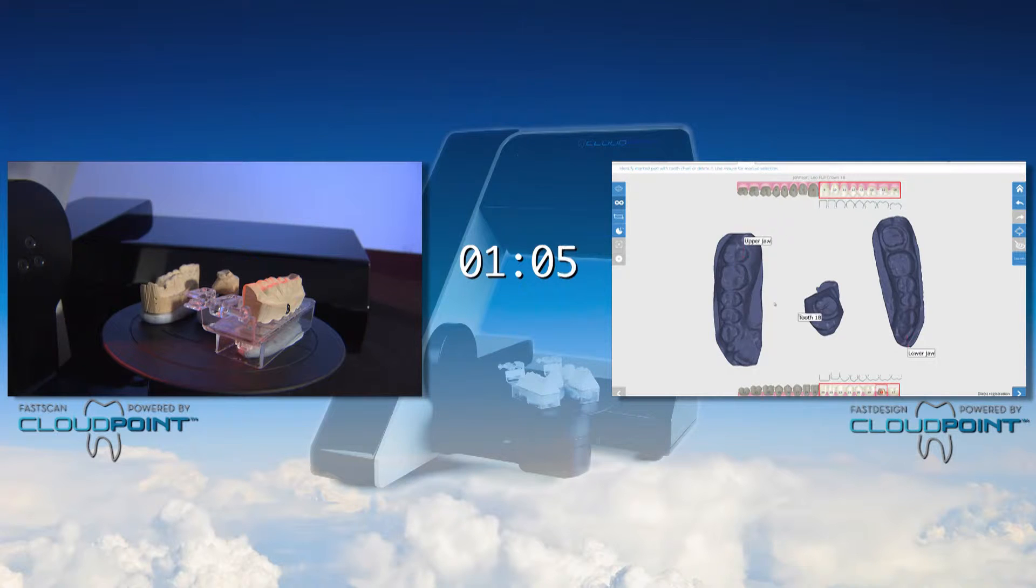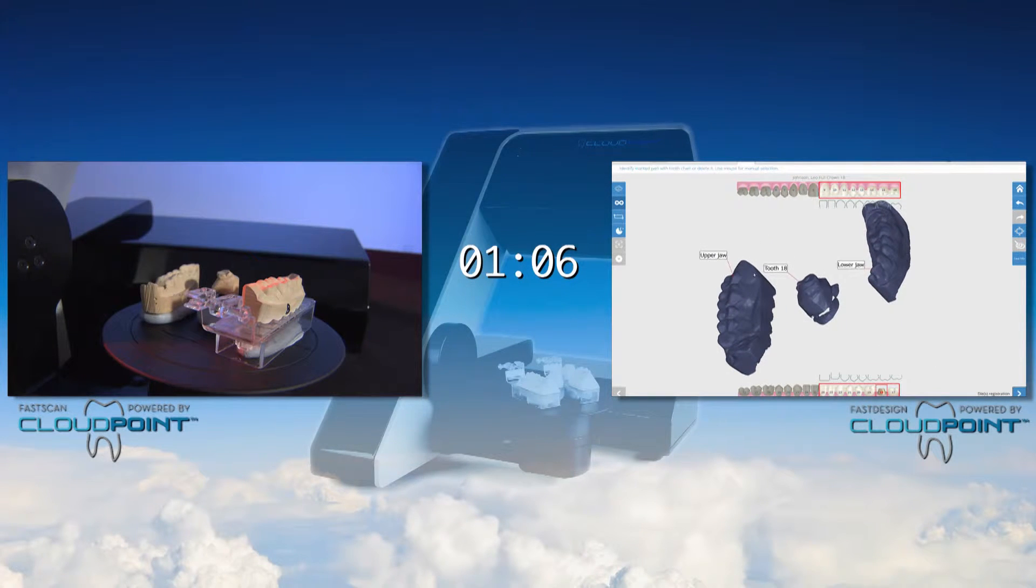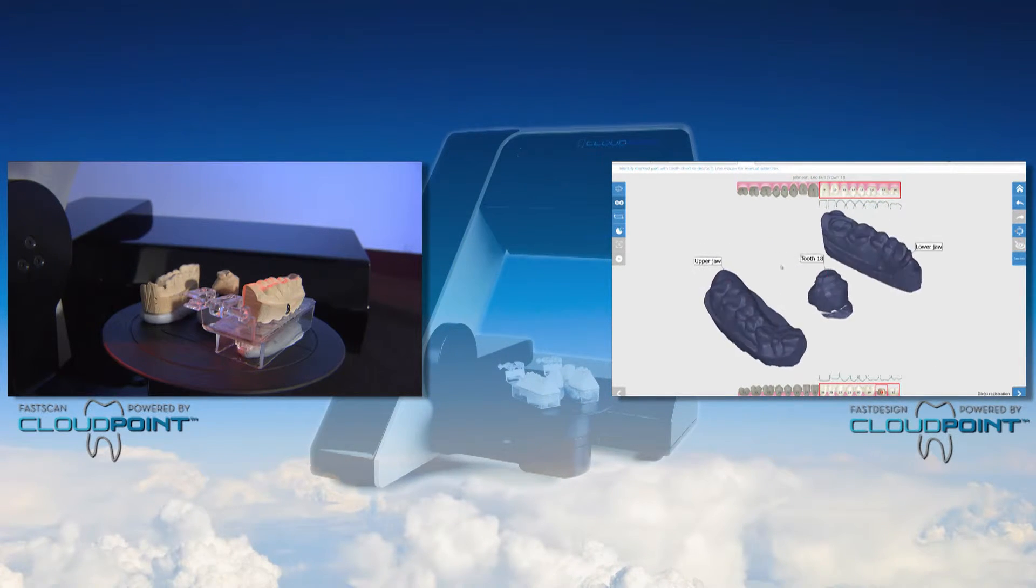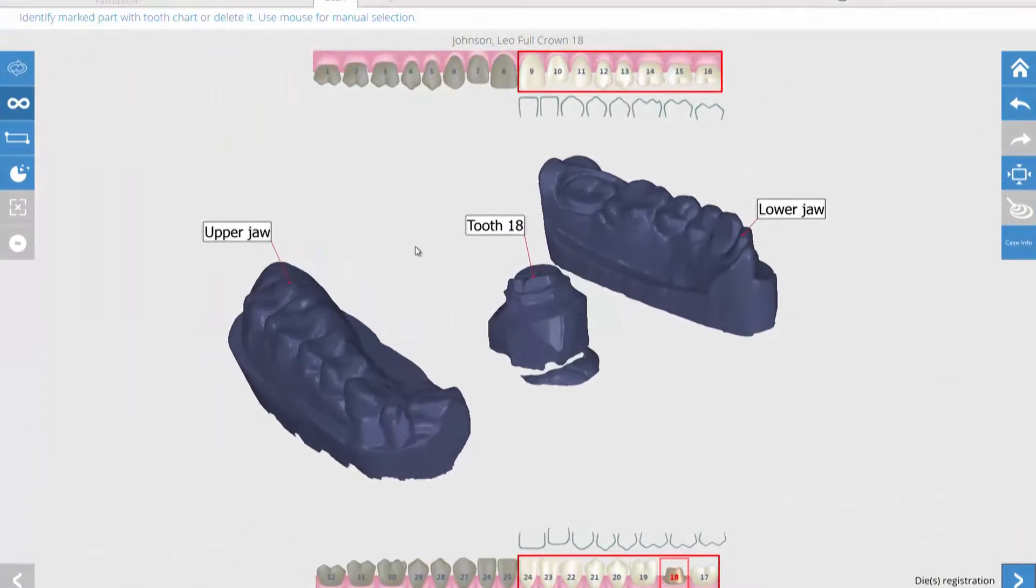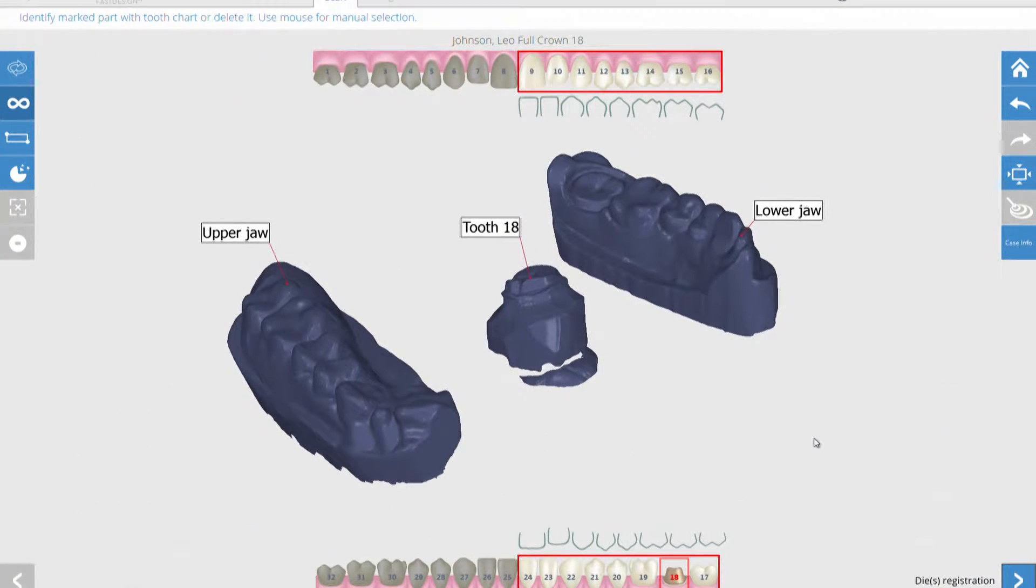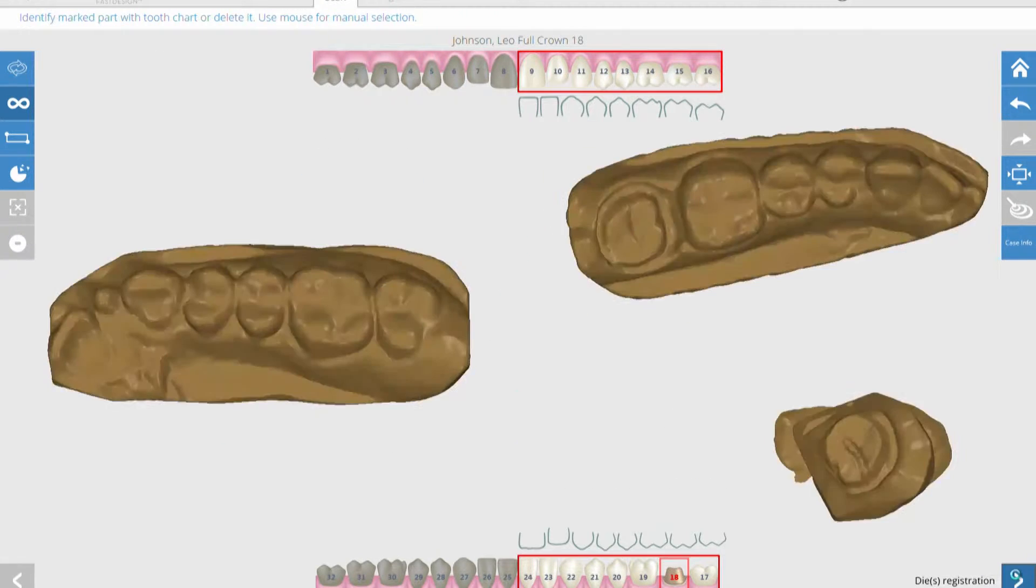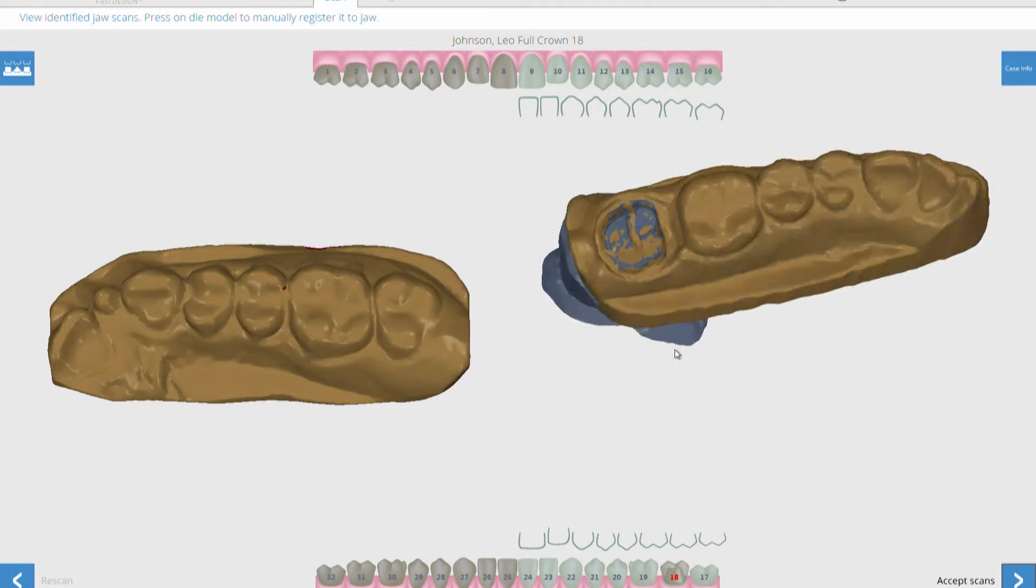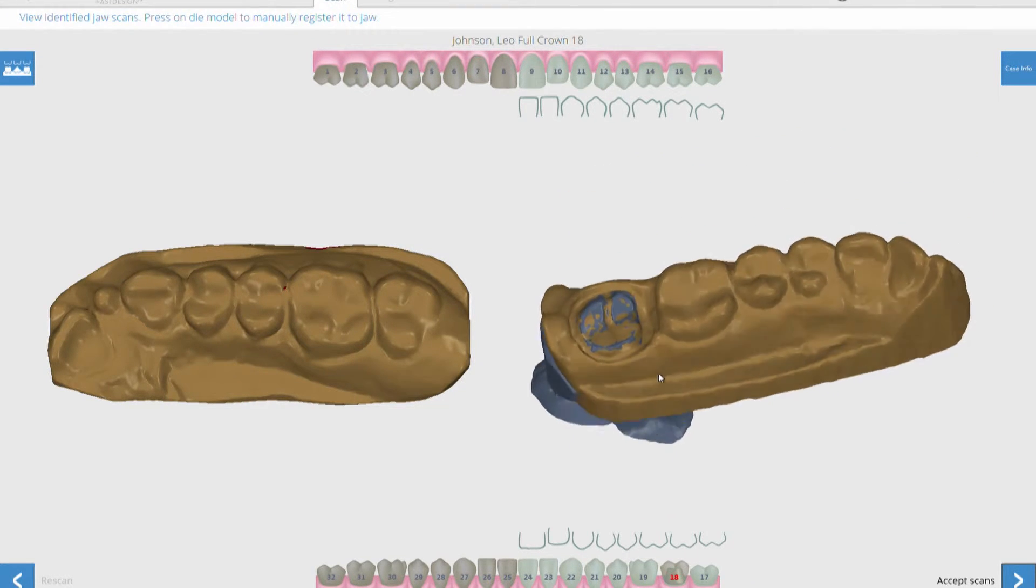All parts are automatically identified within the software. Unlike other systems where you have to identify each part manually, CloudPoint automatically identifies them for you. This auto registration of the master die to the solid model eliminates the variation that can occur within manual registration and saves you time.